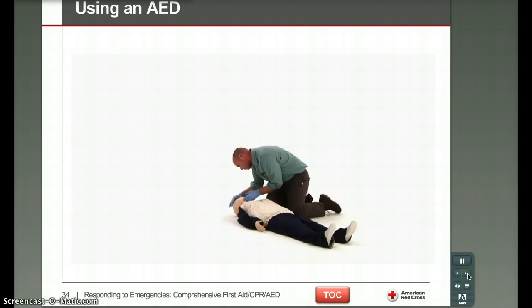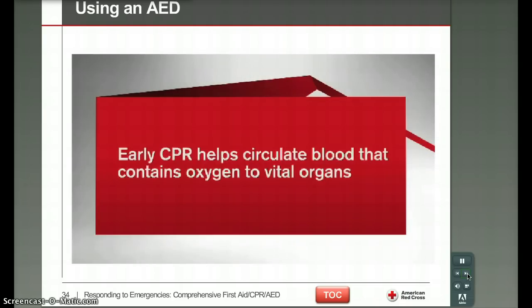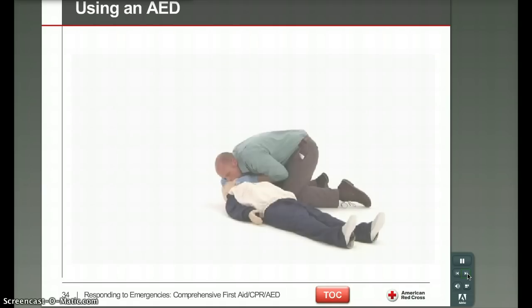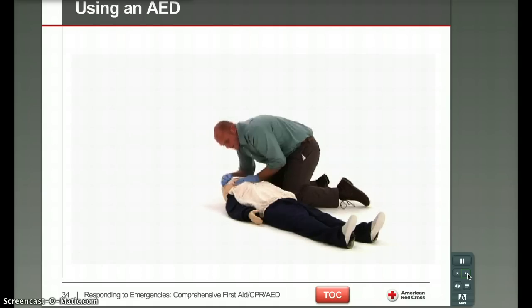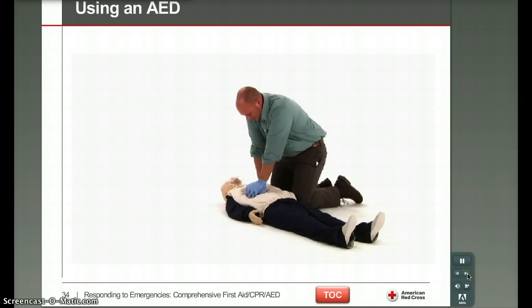Following the links of the cardiac chain of survival can help save lives. The sooner 911 is called, the sooner advanced medical care will arrive. Early CPR helps circulate blood that contains oxygen to vital organs. Most people experiencing sudden cardiac arrest need an electrical shock called defibrillation. Continue CPR until an AED is ready to use.